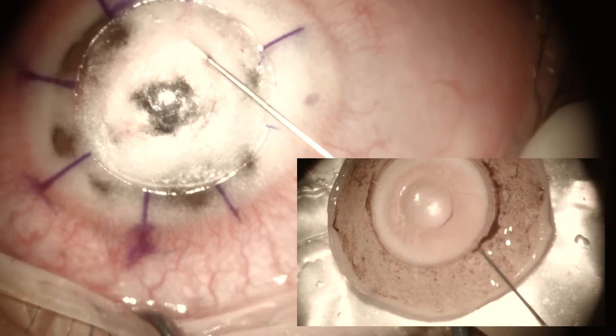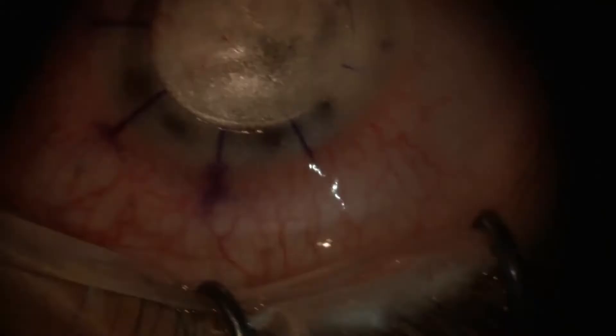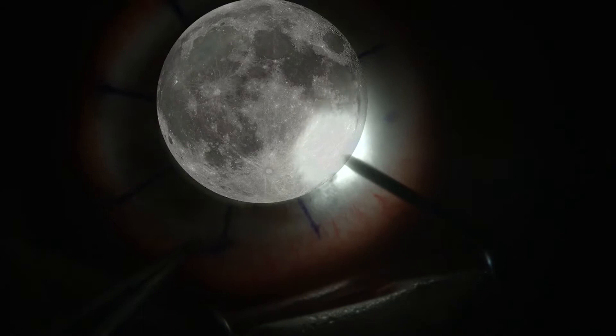Here we show some examples of type 1 bubbles discovered with this technique. We also show an internal view in a research cornea. The air is injected as usual. Once the cornea is white, turning off the microscope and the ambient lights, we proceed with the transillumination technique. The probe is in direct contact with the cornea. We corroborate the existence of the big bubble type 1, where we can see the full border of the bubble in 360 degrees. We call this sign 'full moon.' This image is created because of the phenomenon called total reflection of the light over the bubble walls.